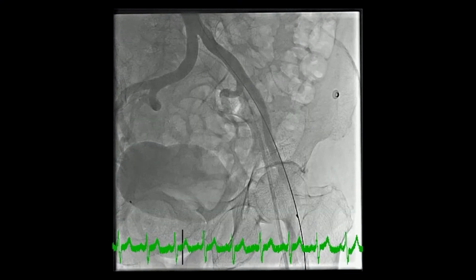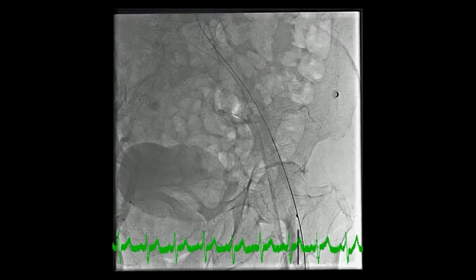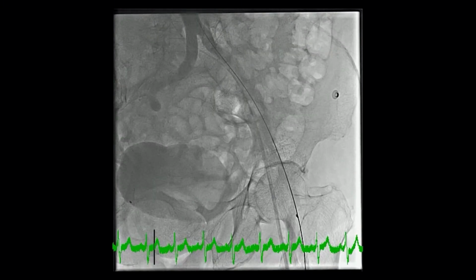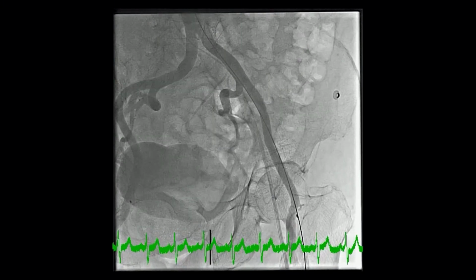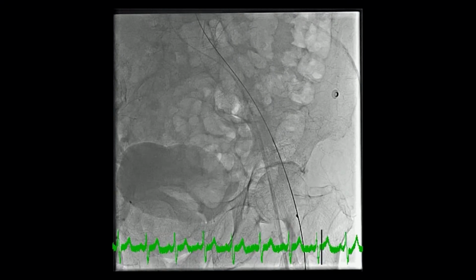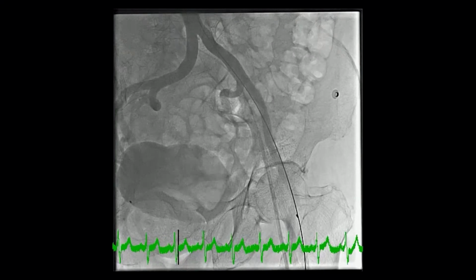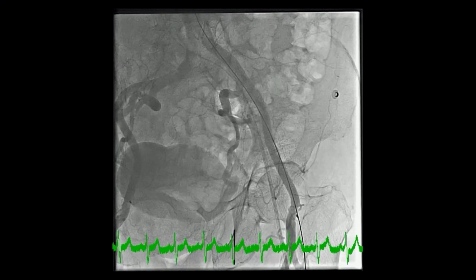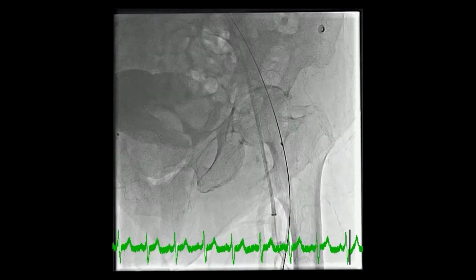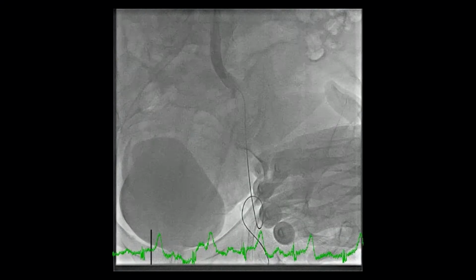It was the left femoral artery, it was a bailout procedure because we couldn't advance the Sapien 3 that was already inside the aorta of the patient. We couldn't advance through the aortic valve, and we had to perform a predilation with a balloon. So we had to introduce a 12 French sheath in the left femoral artery, and we performed the closure in the end with a Manta 14 French. So also a nice case to describe.